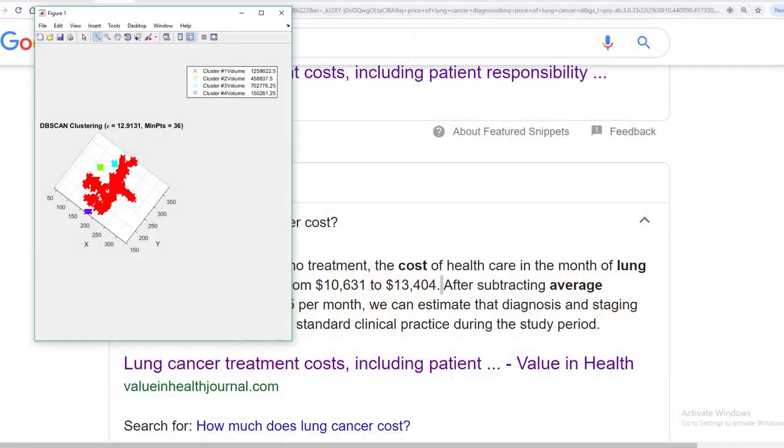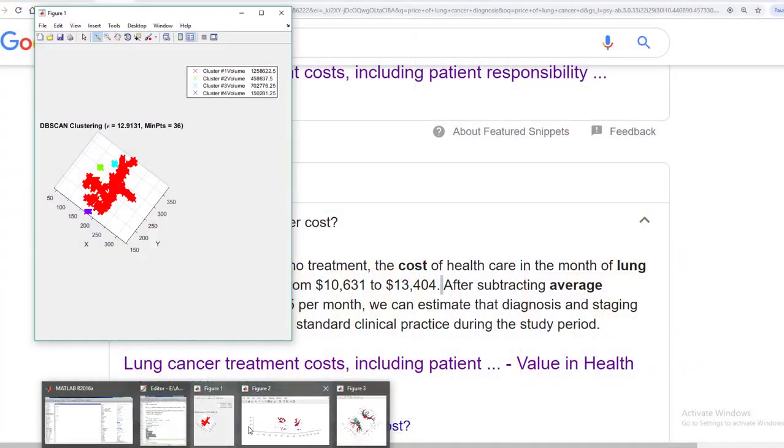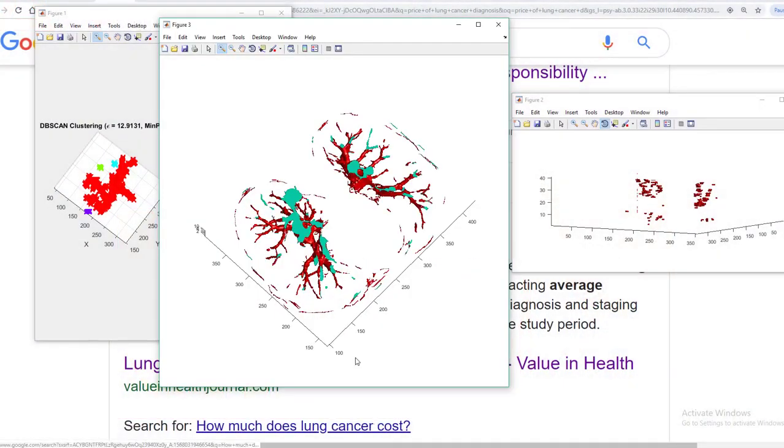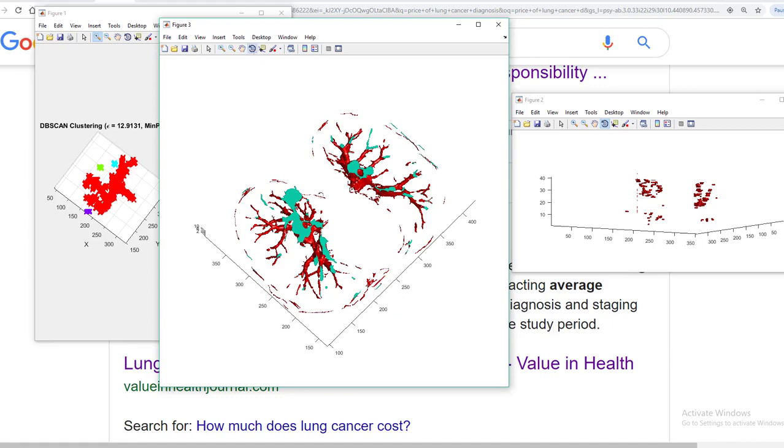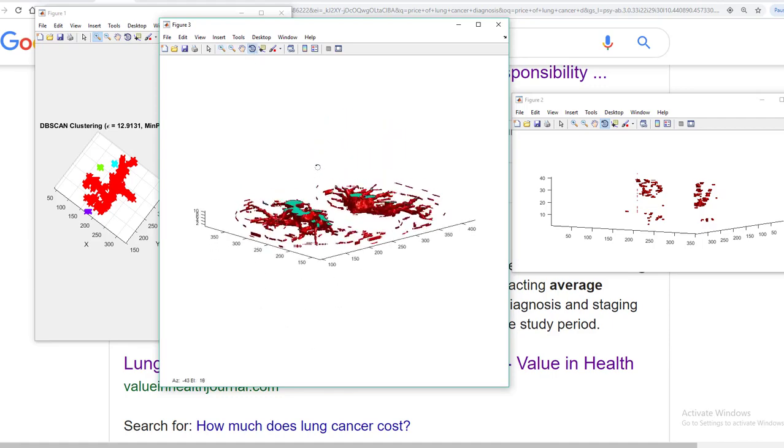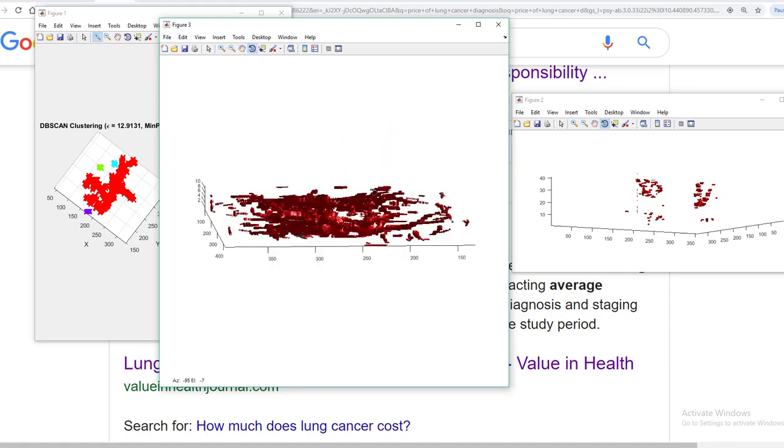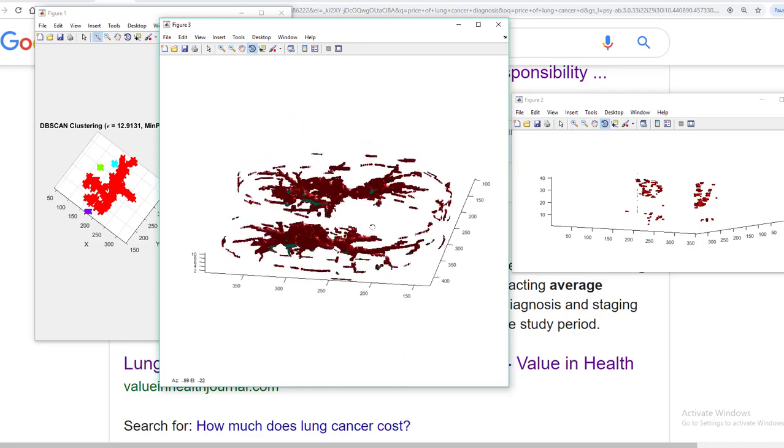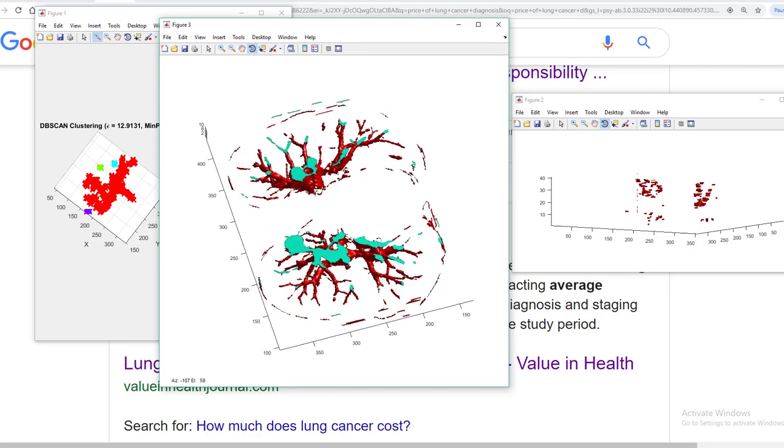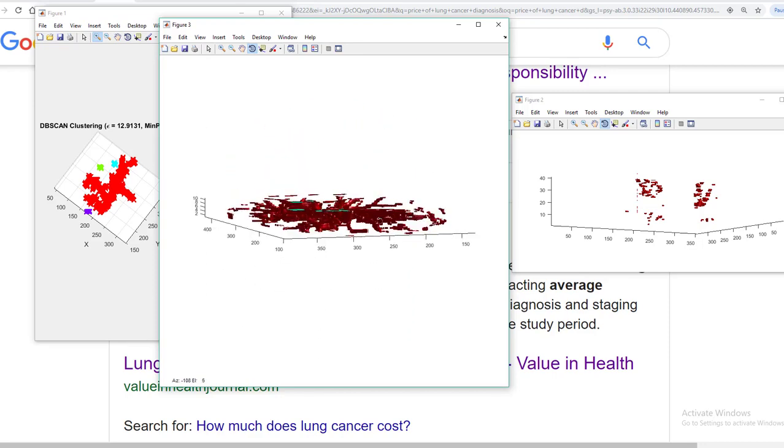So these are some outputs I have obtained. I'll explain you one by one. This is my first output guys. What this output is all about? This output is showing you the lung nodules 3D map.